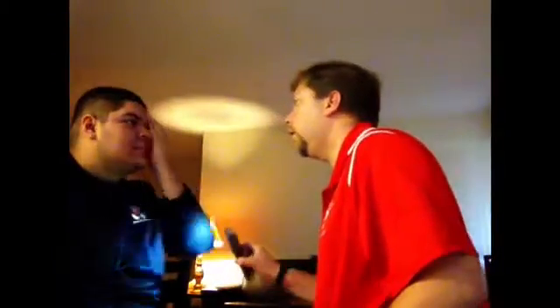So go ahead and cover that eye for me and open up. Okay, then cover the other.